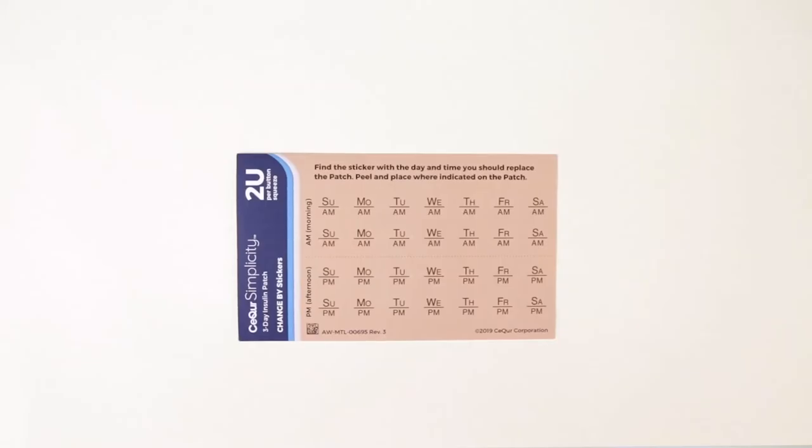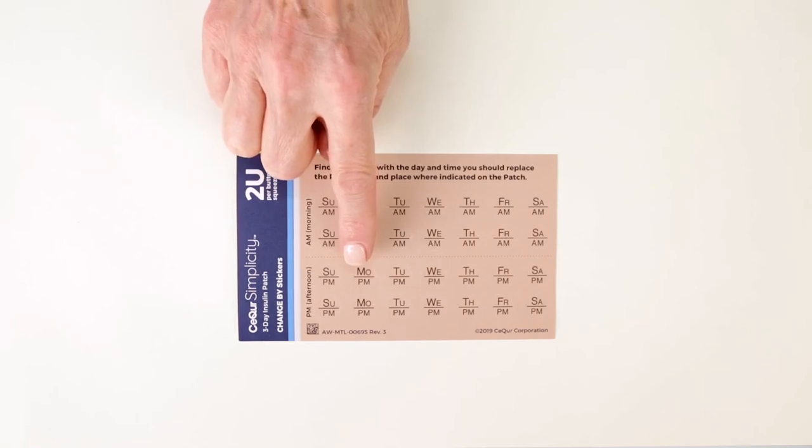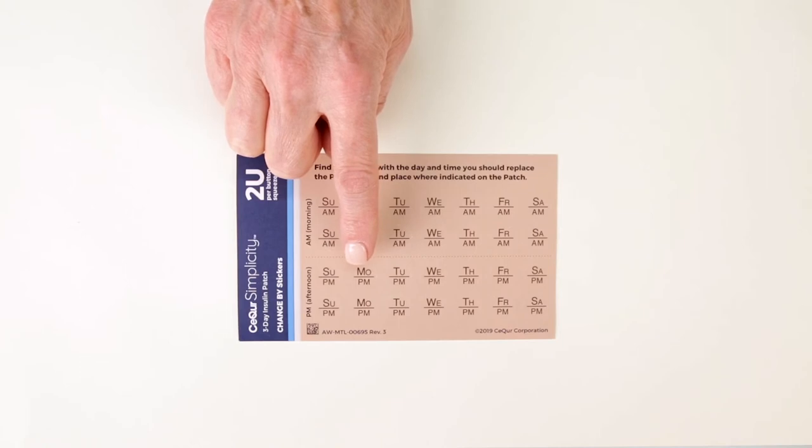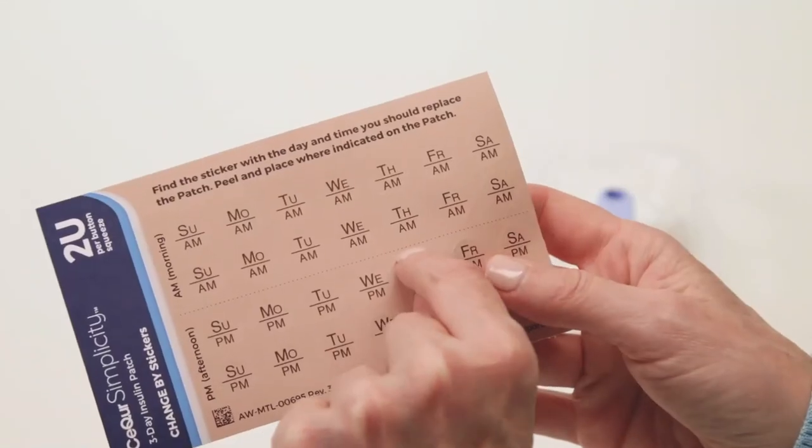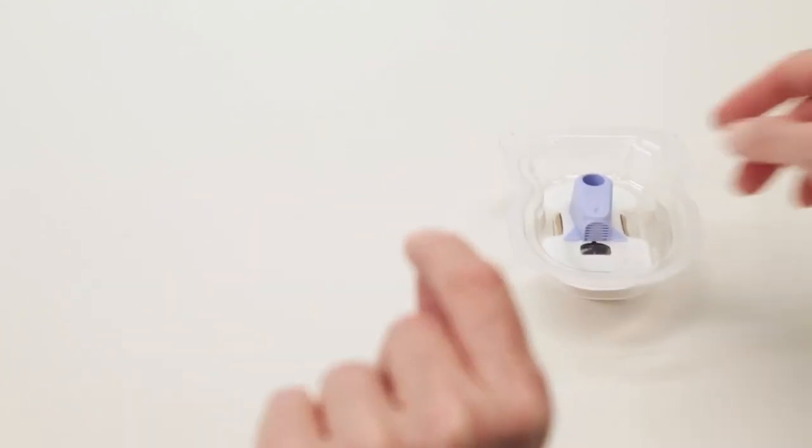The change-by stickers remind you of the day and time to change the patch. For example, if it is now Monday afternoon and you just filled the patch with enough insulin to last three days, count forward three days to Thursday afternoon. Peel off the sticker and place it on the patch.